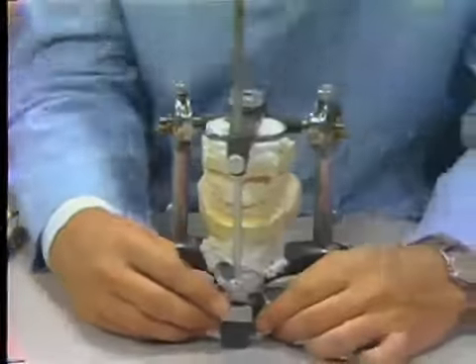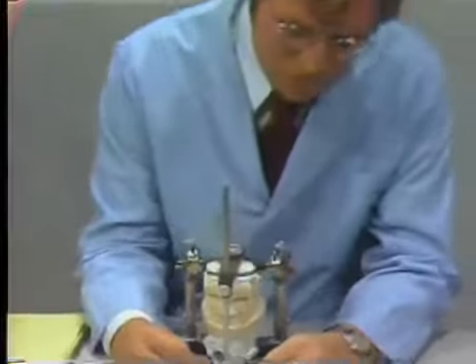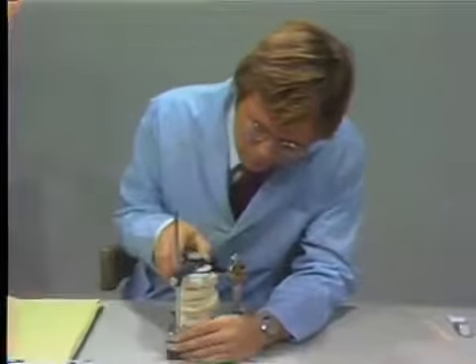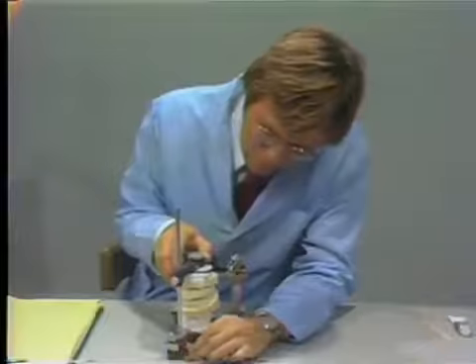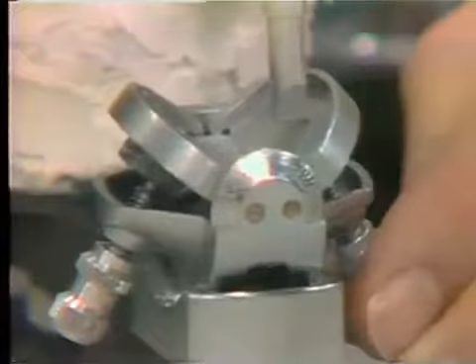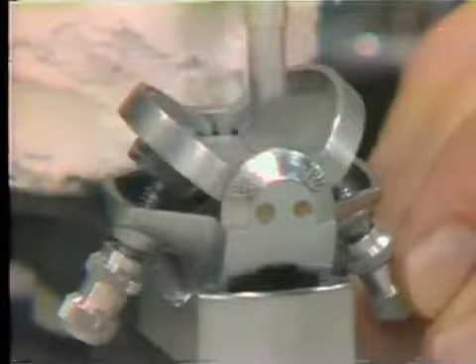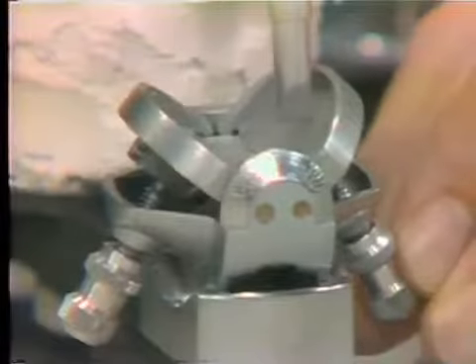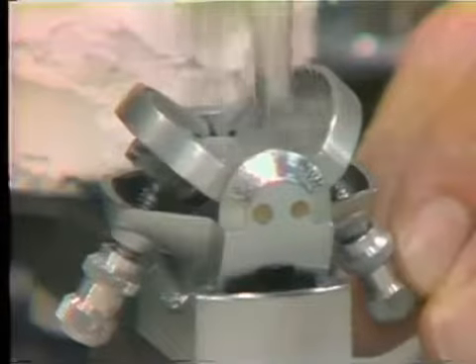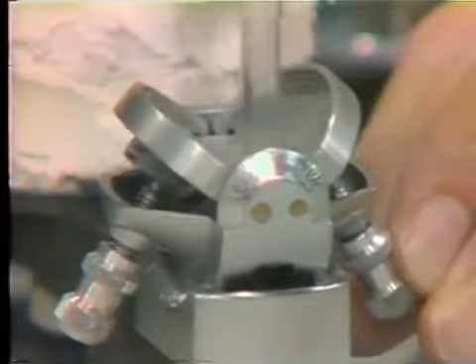Now I should do this bilaterally first. I will now move the articulator to the left and raise the lateral wing with the screw on the side until it touches the table. And this is providing the guidance now in this lateral excursion.